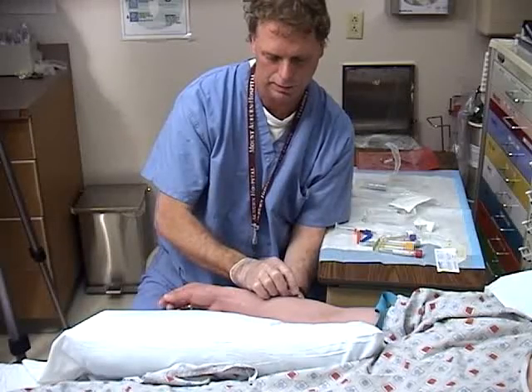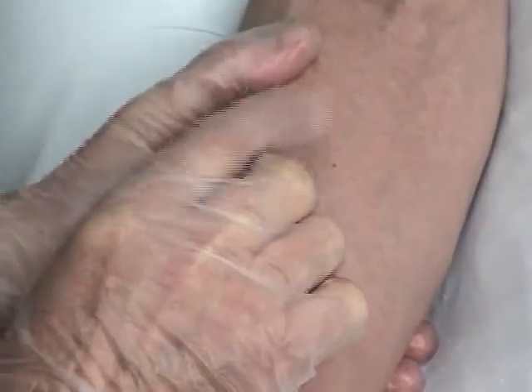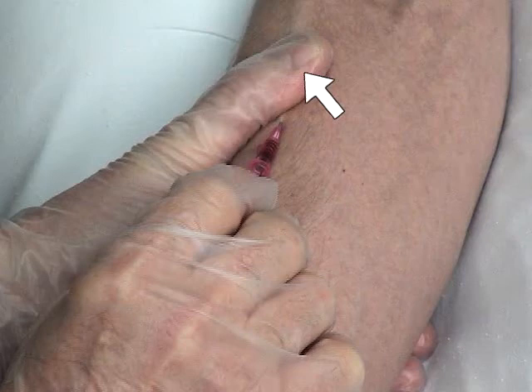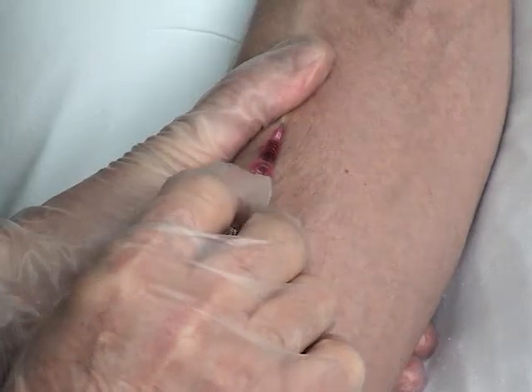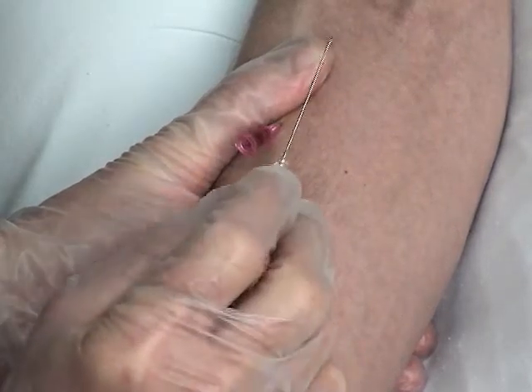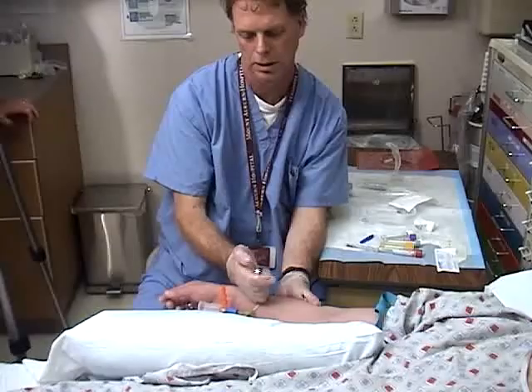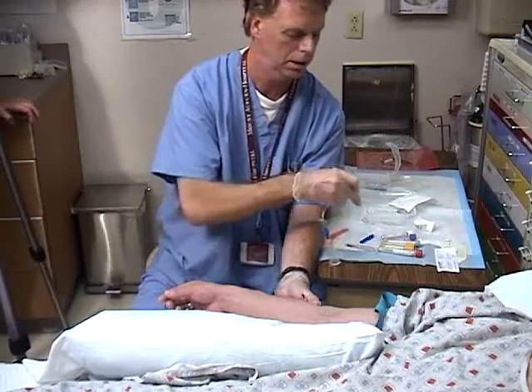Once the catheter is fully advanced, release the traction and use your non-dominant hand to apply tamponade to the vessel by pressing down firmly in the region of the tip of the catheter. This prevents spillage of blood when the needle is removed. Next, remove the needle from the catheter and activate the safety mechanism.